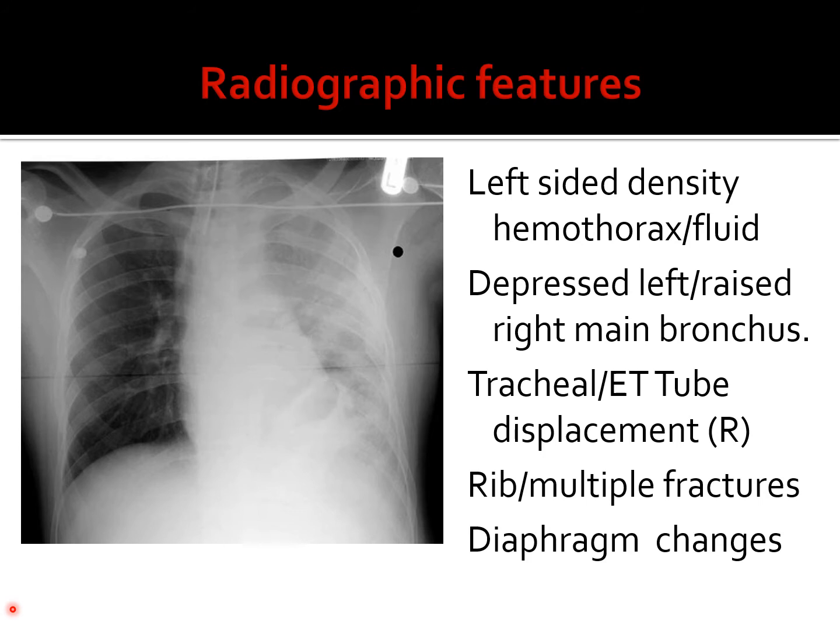There may be multiple rib fractures, and usually they are the posterior ribs of the chest. There can also be involvement of the anterior chest depending on the site of injury. Usually, if it is the anterior chest ribs that are injured, the rupture involves the ascending aorta. For rib fractures in the posterior ribs, usually what is involved is the part of the aorta that is posteriorly located. There may also be diaphragmatic changes secondary to the fluid collection in the hemithorax.